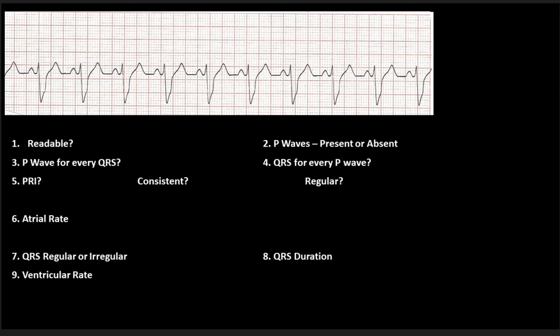This is something that most likely is a delay that is going to occur inside the ventricles. Because we are using a single lead, we are here in this rhythm interpreting it in lead two. We are not going to be able to identify with a single lead whether or not this is going to be a bundle branch block on the right or left side, and we can't tell whether or not there's another type of conduction abnormality.